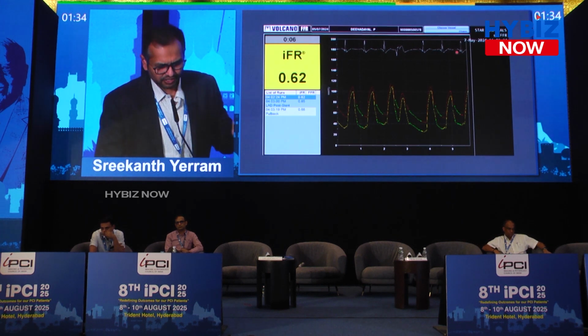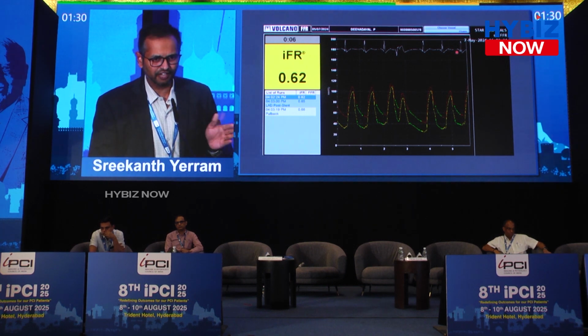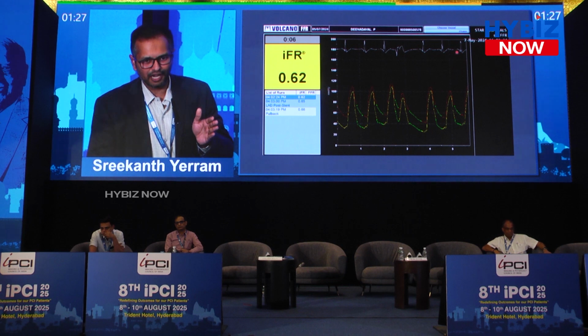So this was a patient, one of ours, where you can see the patient is doing recurrent ectopics. When we are doing IFRs, you keep getting little different values. Even though it was significant, you get different values when somebody has unstable rhythms.